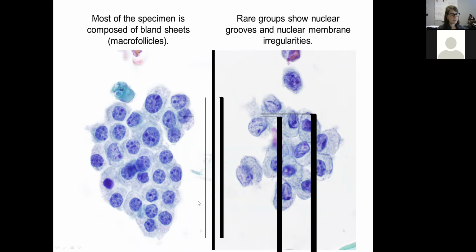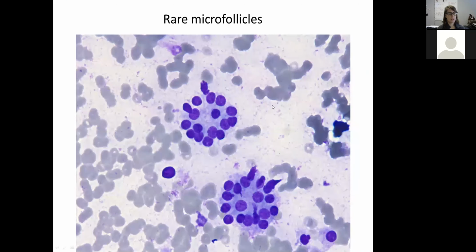So one person has voted and has correctly said AUS, nuclear atypia. So this is an example of a specimen where nuclear atypia is present, but it's quite focal and somewhat minimal. Therefore, we're not ready to call this malignant papillary carcinoma yet. However, there are these nuclear features that are starting to resemble it.